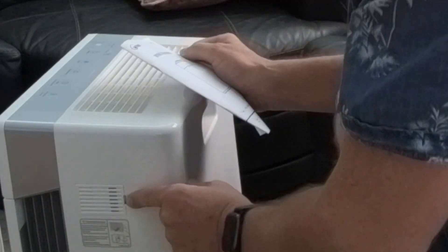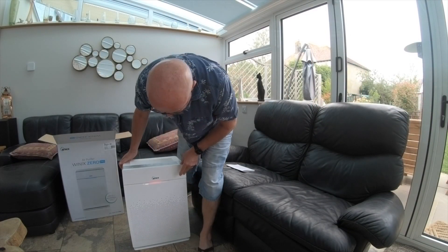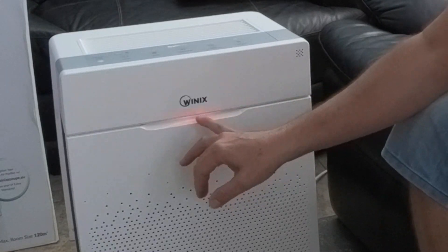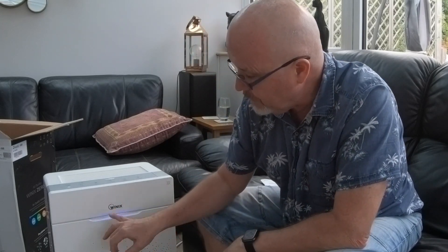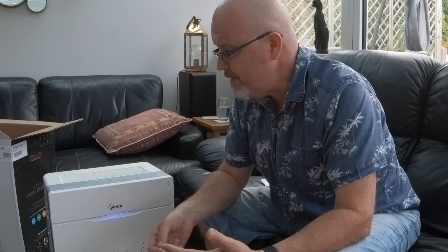There's a particle sensor — a little door on the side with a lens where air is drawn in and light is used to measure particulates. That's what I really like about this unit: the illumination that tells you air quality. Red is poor, orange is fair, green is average, and blue is good. I took it to the surgery and with our ventilation system it was always on blue, and apparently it's on blue here at home too.